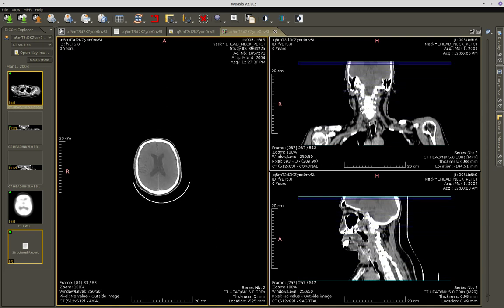You can see the image above. This one is very clear, even for me, who is not very versed in anatomy, you can see the shapes, but from the profile, it's not so good.